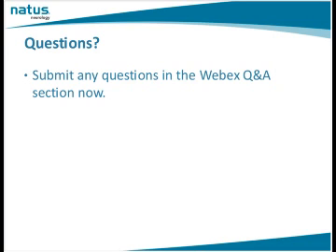For those of you that were at our collateral presentation and the 3D presentation with John McCartney, if you can remember, about 20% of people have a fetal origin PCA, which means either it's congenitally absent or it's misplaced. So if you're fishing around to find the PCA every single time, you're really doing an injustice to yourself, the patient, and your interpreter, because it will not be there 100% of the time. I hope that answers the question.